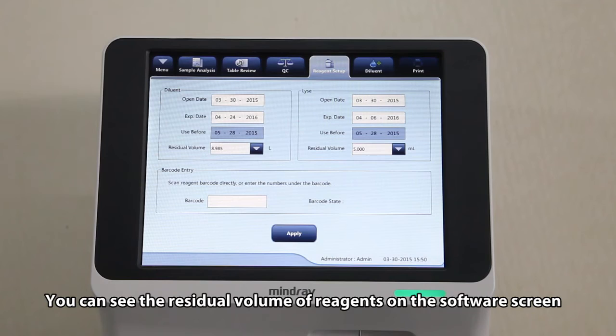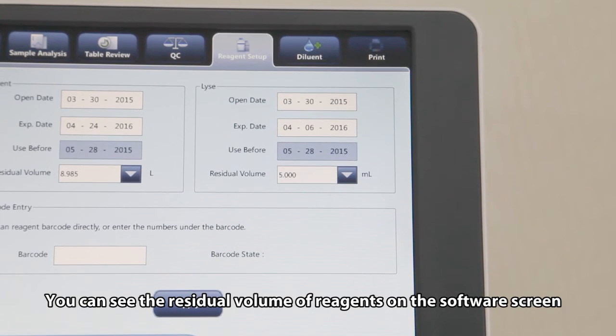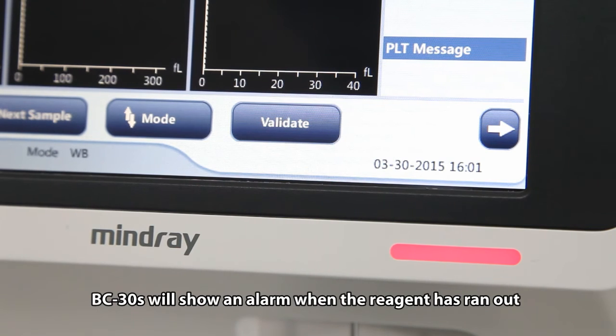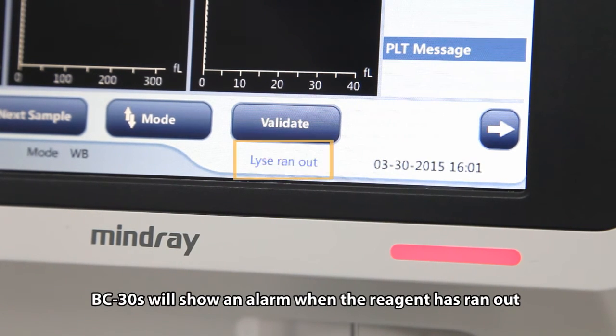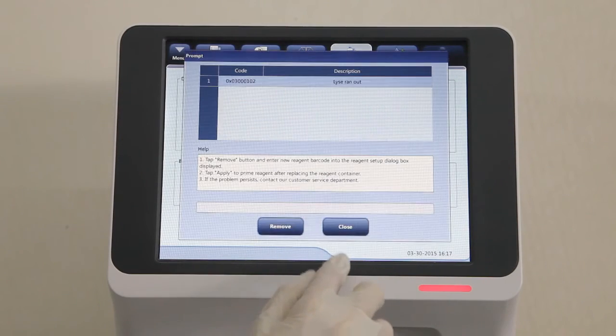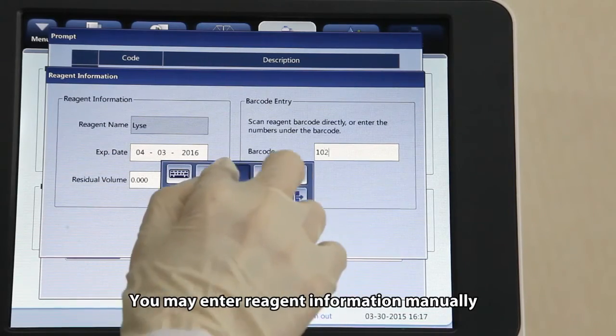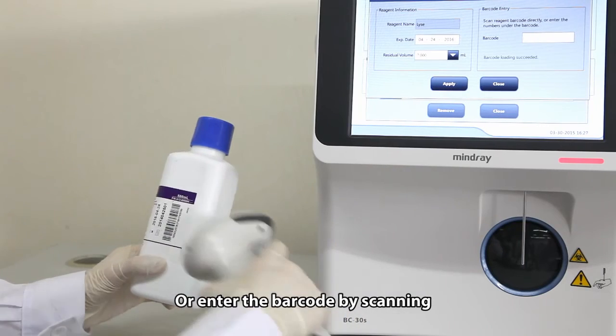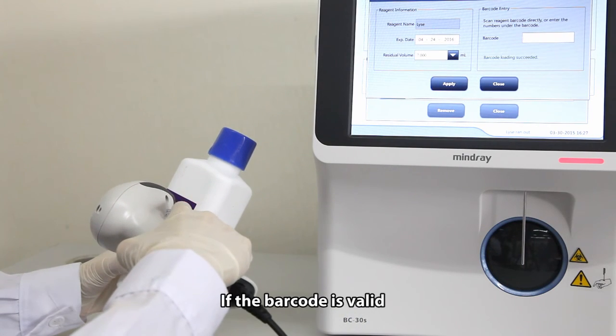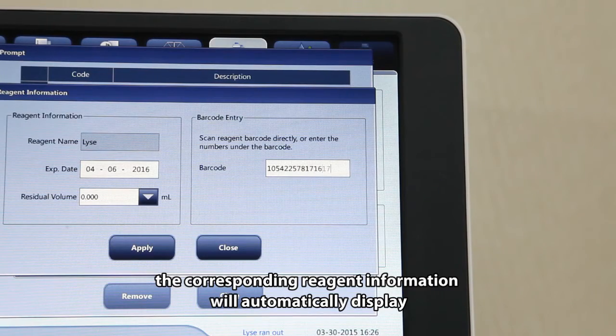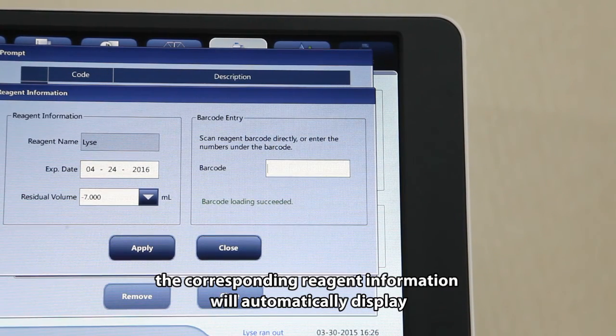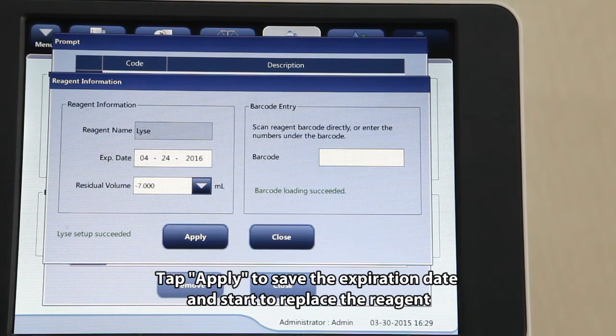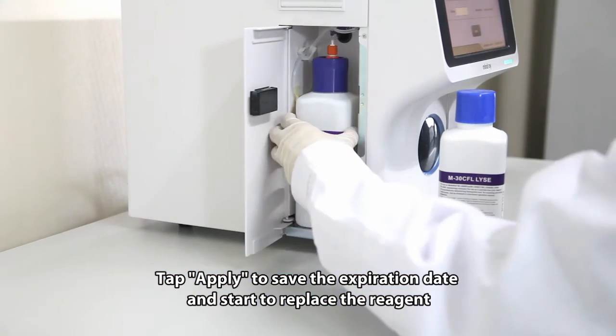You can see the residual volume of reagents on the software screen. BC-30S will show an alarm when the reagent has run out. You may enter reagent information manually or enter the barcode by scanning. If the barcode is valid, the corresponding reagent information will automatically display. Tap Apply to save the expiration date and start to replace the reagent.